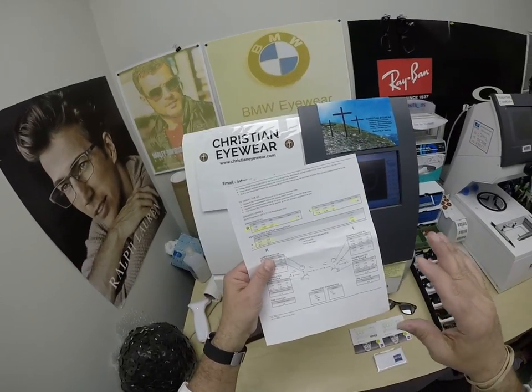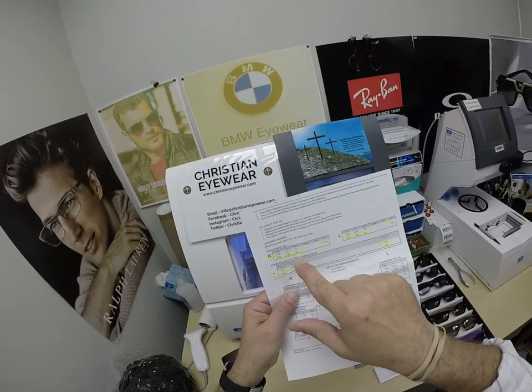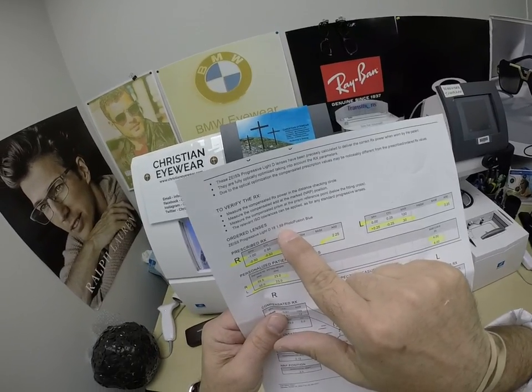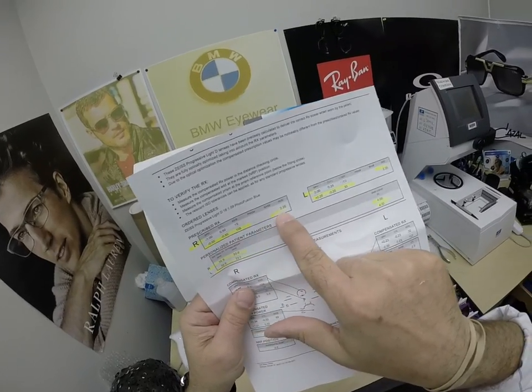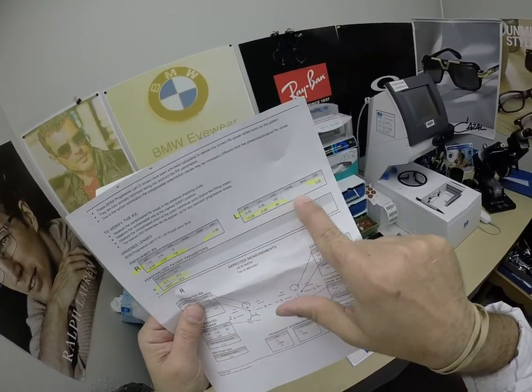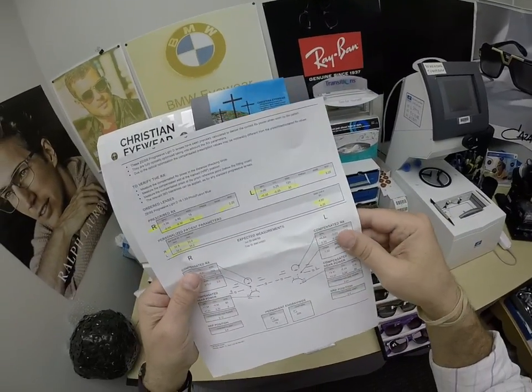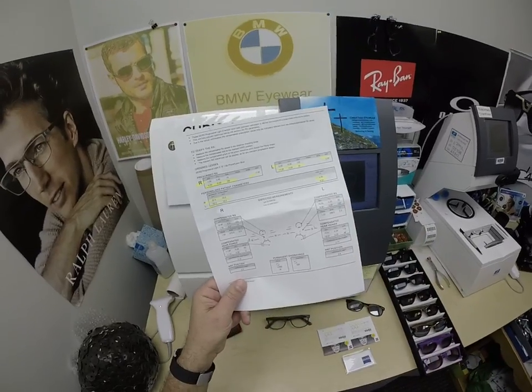With everything you get, you get all the original packaging from the manufacturer. You get an 8x11 piece of paper from Zeiss. This is your Zeiss progressive Light D 1.59 — the refractive index of polycarbonate — Photofusion Blue. I've highlighted the prescription for the right eye for bifocal strength, same for the left eye, bifocal strength, pupillary distance, optical center height, even the base curve of the lens. That's what I love about Zeiss — how they document everything.